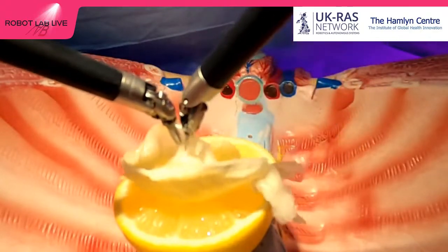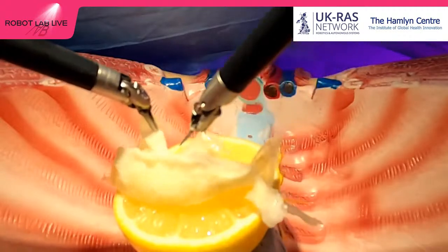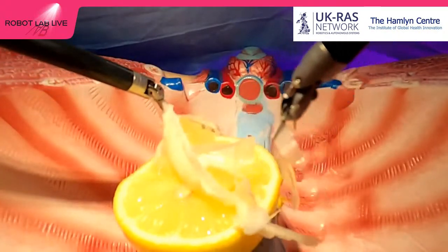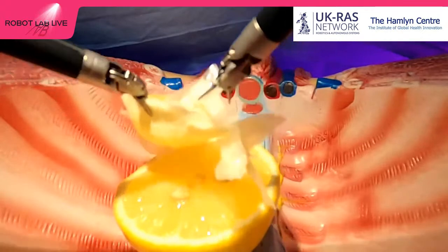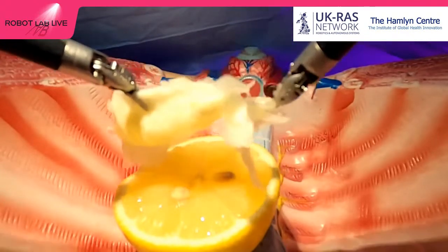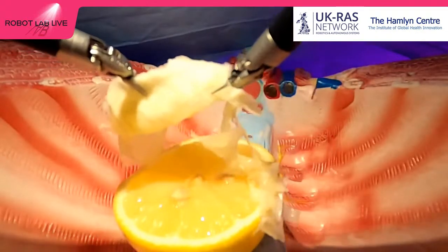But if you think of your own body, like just placing the hand on your chest, you can feel the movement, or you can feel the heartbeats of your heart, right? And this is something that we have to teach the robot to understand, to compensate for all this motion, right? So we are doing research in this line, and other important things to take into account is how do we decide the target for our robot.